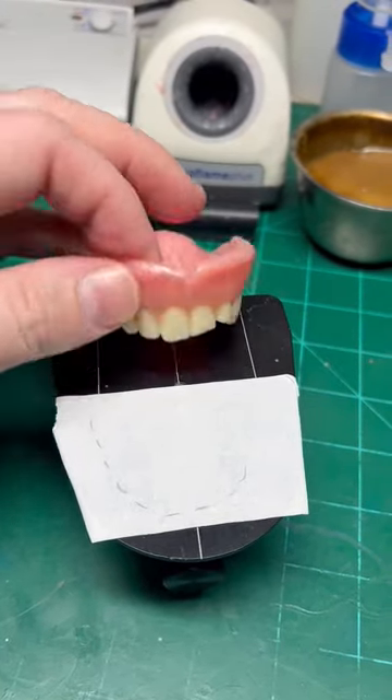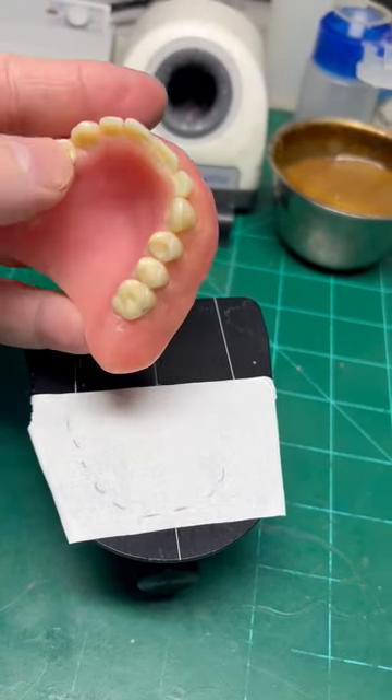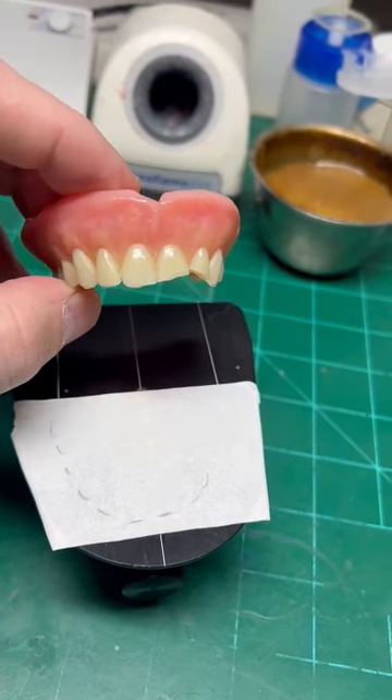Hi everybody, so today we're going to be repairing this denture where we have three anterior teeth that are fractured. It's got some posterior wear as well, but at this point we're just addressing the two centrals and the lateral that's fractured off.